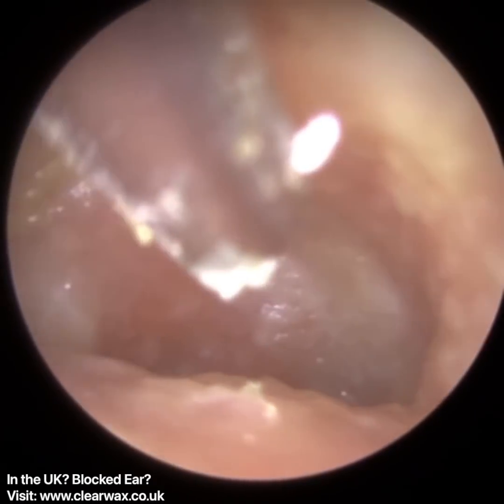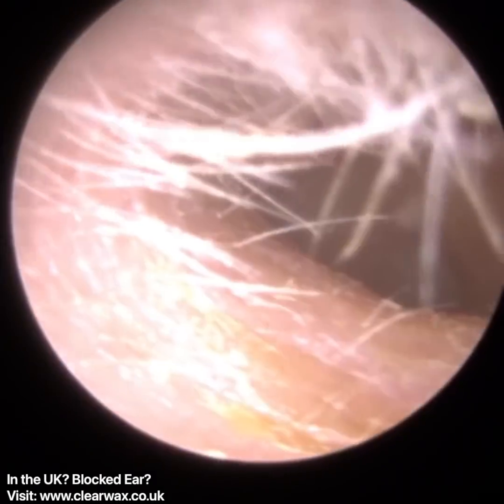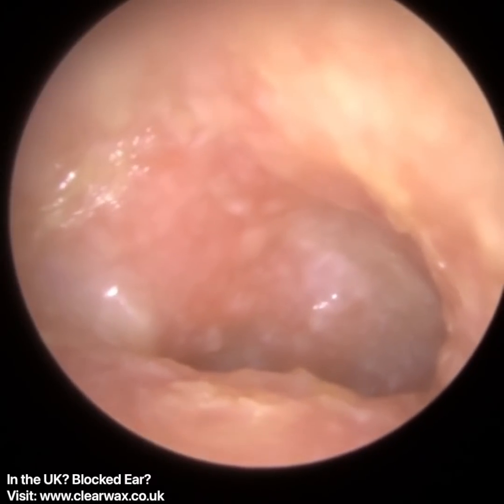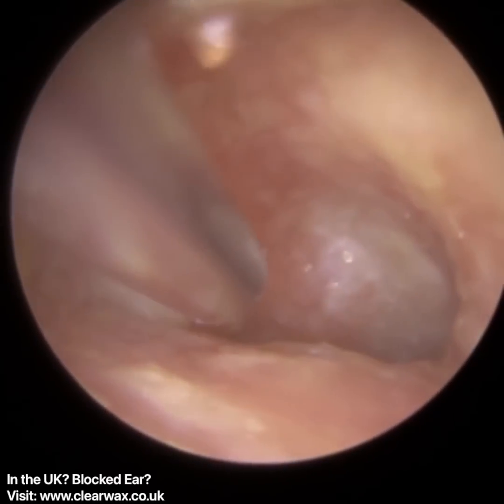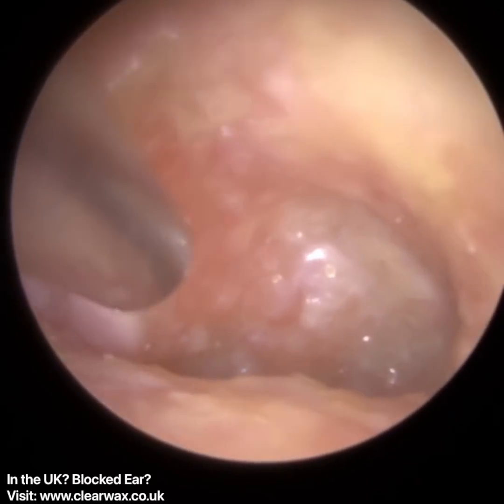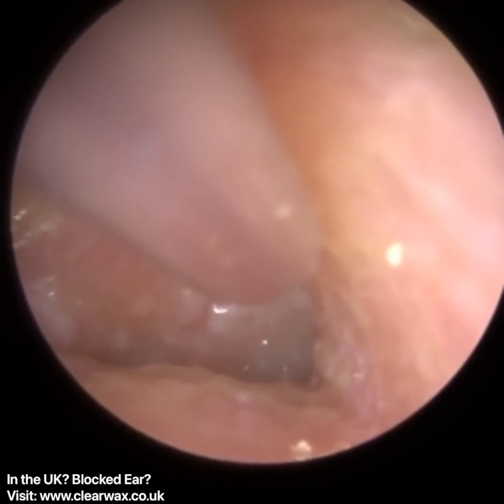But over a period of time, if you regularly clean it, it can get on top of it, or definitely assist, I would say. So it's not the silver bullet, but it will definitely assist when using any sort of ointments. So you can see the eardrum's fully visible. It is quite inflamed in there. They have got an upcoming appointment with the ENT. Hopefully they can prescribe or apply some topical cream within the ear to help this infection.